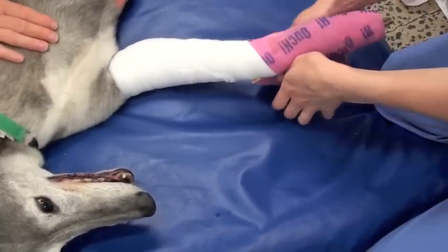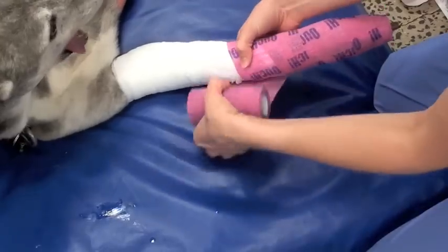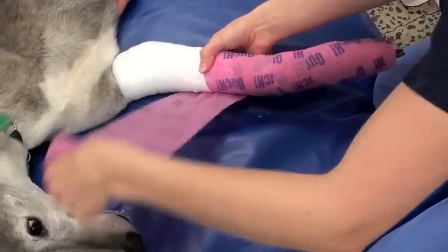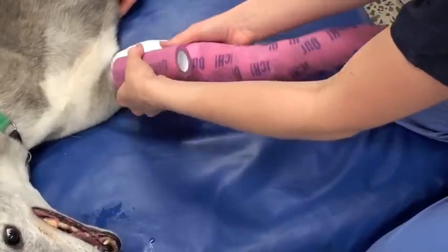Following the placement of the stirrups, we use an elastic bandage — something like Vetwrap or Coflex — and again this can be placed too tightly. It's important to pull it just tight enough so that the wrinkles in the product are just about to disappear, but not so that they completely disappear. So again, very important.